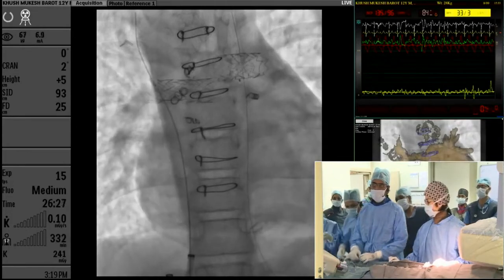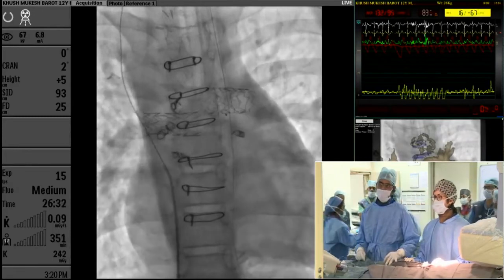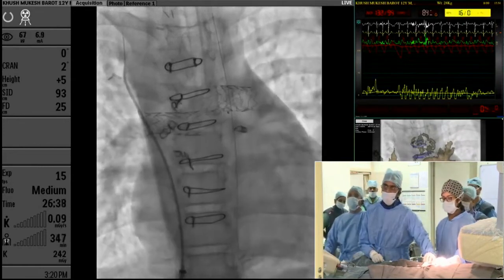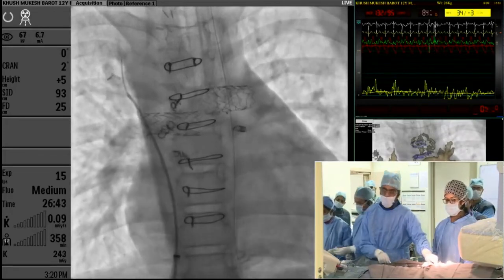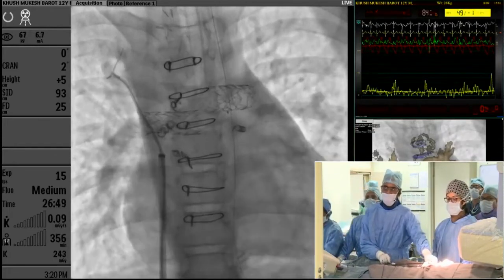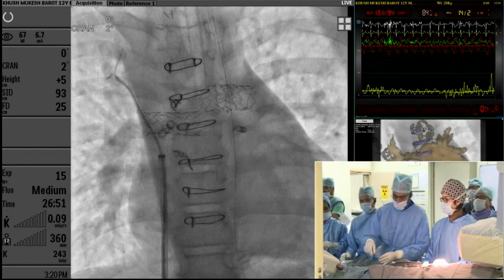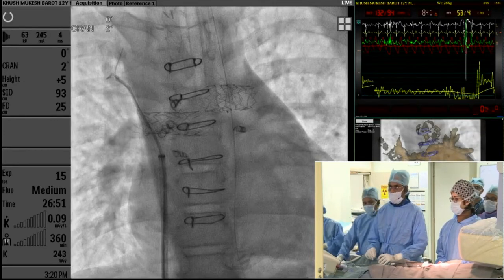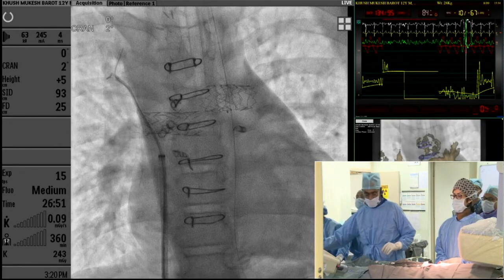See, this patient had a right modified BT shunt in the past, which often produces some amount of cicatrix within the right pulmonary artery in its upper branch, and this results in some degree of poor arborization on the right. This child, if you remember, had a right superior vena cava stenosis. So now I'm going to record the right superior vena cava pressure. Show the superior vena cava pressure. Zero your line.